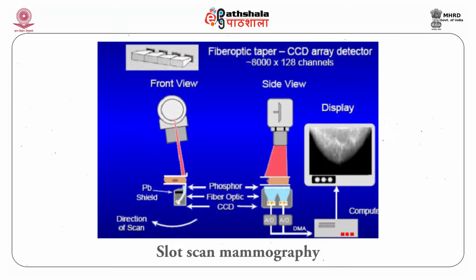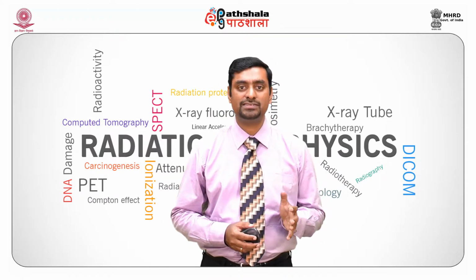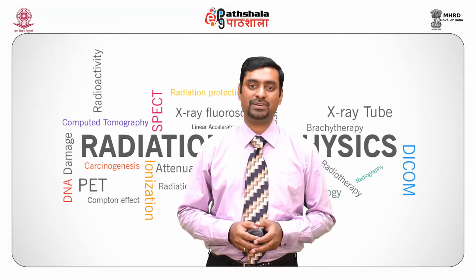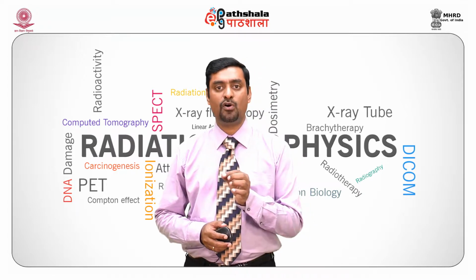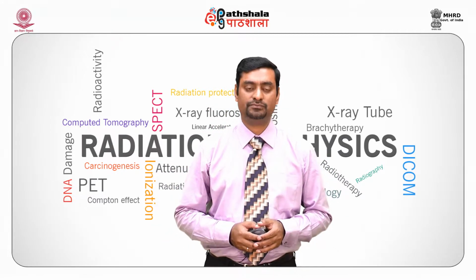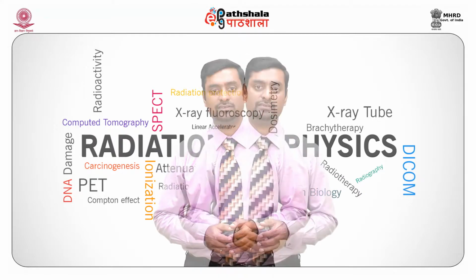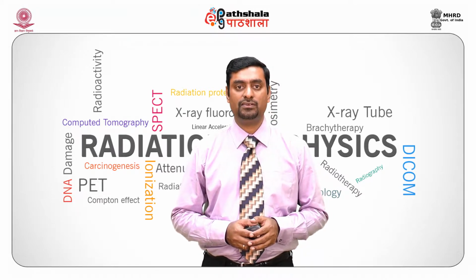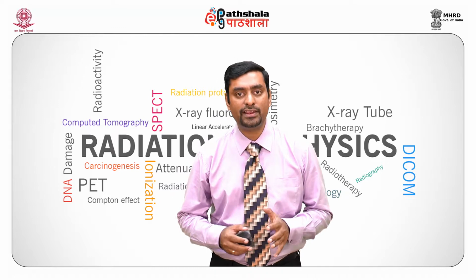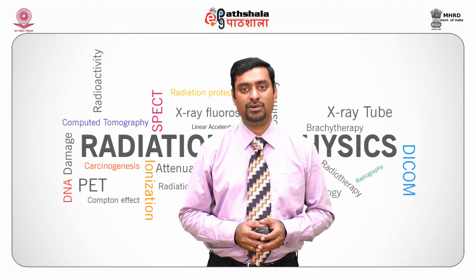How does it work? A collimated narrow fan beam of X-rays scans synchronously across a full field of view covering the entire breast tissue. This is just a small slit which is present in the mammography system. The transmitted X-rays fall onto a thallium activated cesium iodide scintillation material to produce light. The light is channeled through optical coupling to an array of CCD cameras or detectors to form a digital image.